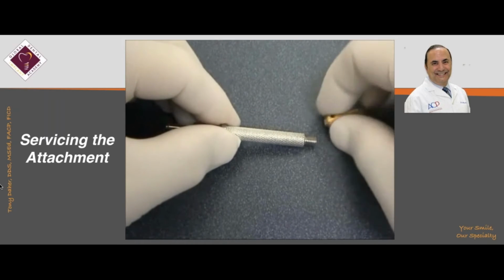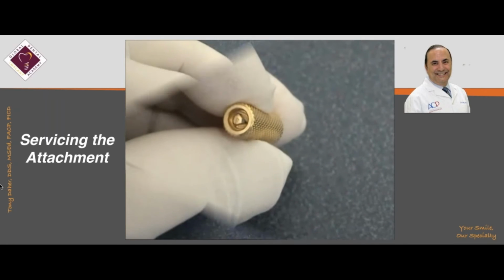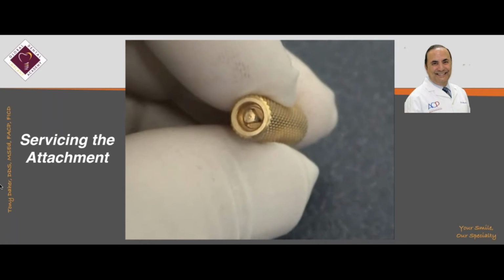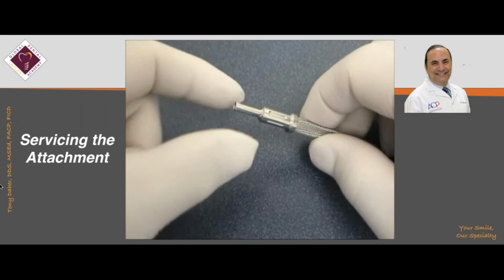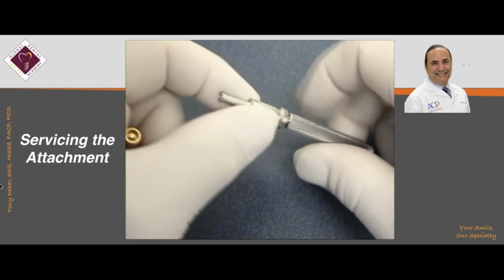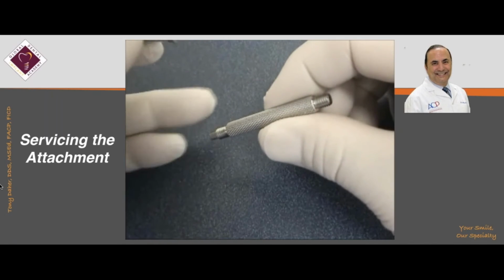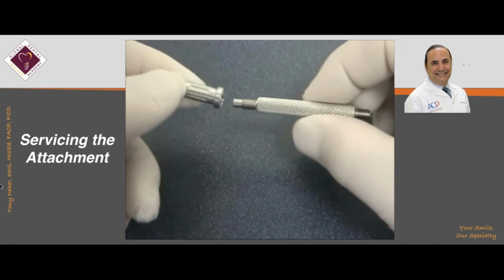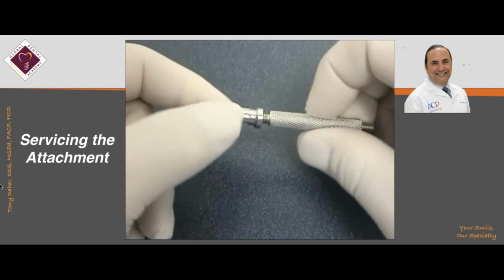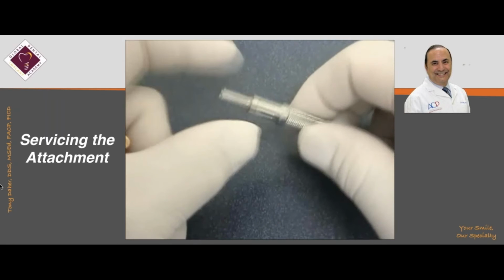And now the insertion and the removal end is the same end on that 3-in-1 tool. So this one here, when you remove that, is your insertion tool. And when you place that portion, it is your removal tool.